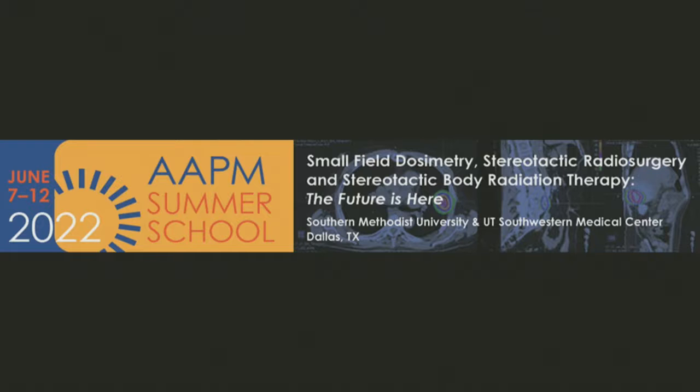We are very careful. We don't use deformable image registration for everything. But more than anything, for adaptive radiotherapy, for example, we really do auto-segmentation, which is not based on deformable image registration. So we also remove the uncertainty of deformable image registration because we do auto-segmentation.